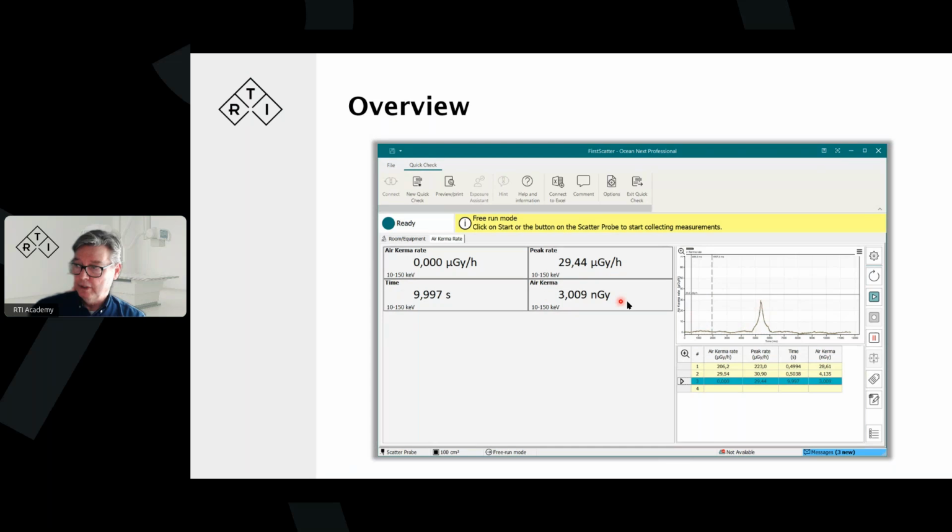Quite low, it's 29 microgray per hour, so it's not terribly strong radiation either, but we're getting something here. And then again, look at the response rate. From here, that's 400 and something milliseconds, and it's up here. So it's less than 1 second until it reaches the maximum of it. So it's less than 1 second response time. Again, just to keep that in mind.